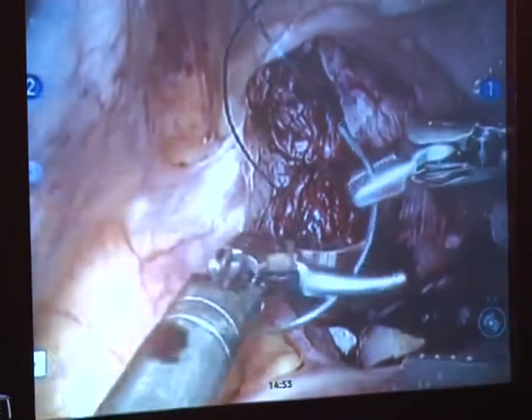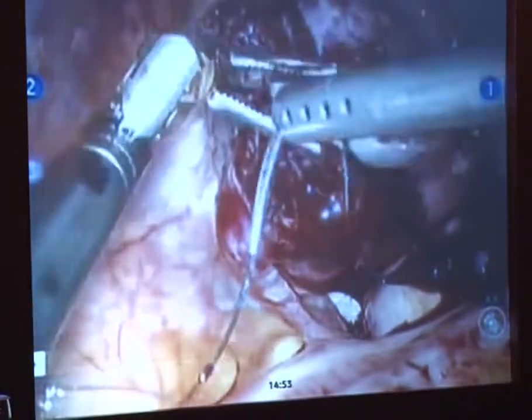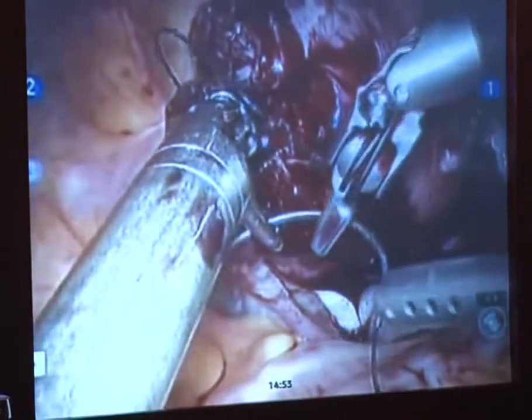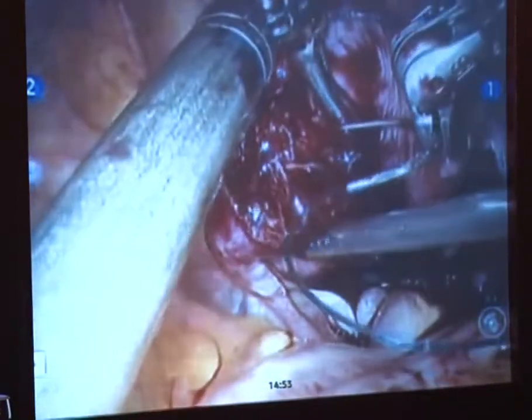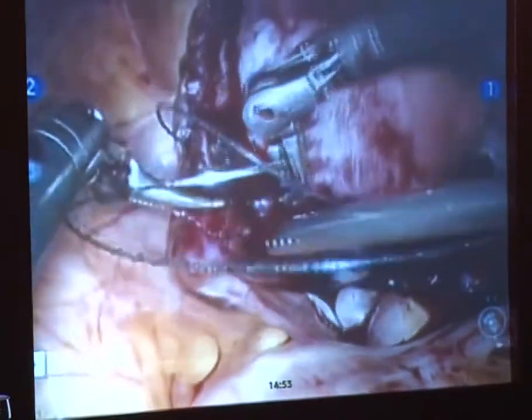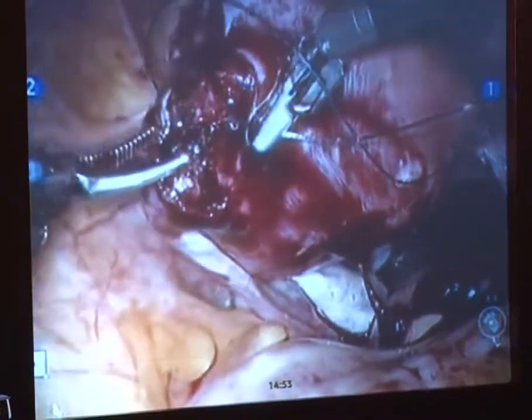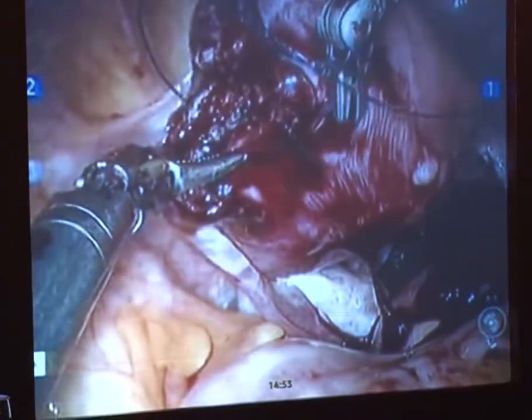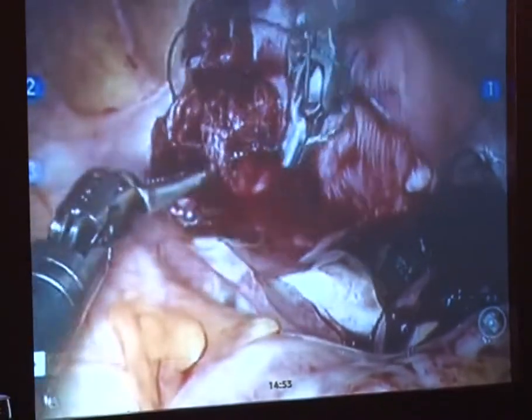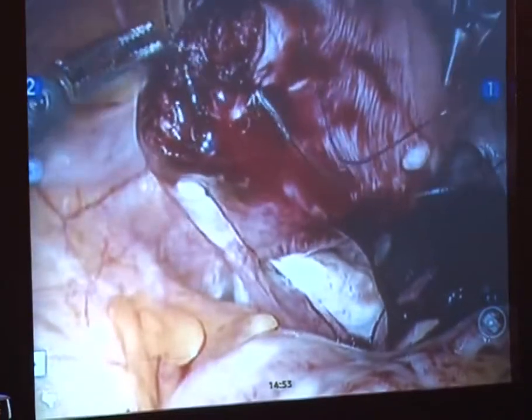What if the endometrium gets opened? Do we suture it or leave it? No, suture it. Don't want to leave that open. With which suture material do you advise? I use a Vicryl suture, like a 3-0 Vicryl, to bring the endometrium together. And once we're done with that closure, then we close it like we normally would. The closure is no different than if you had a problem in an open case. You fix it the same way in a laparoscopic case.